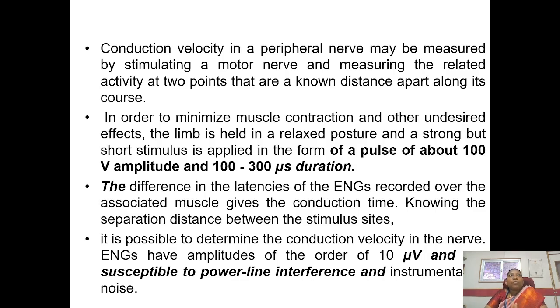In the case of a few patients, like stroke patients or paralysis patients, definitely the nerves will not conduct properly. So for those kinds of patients, how do we check whether the nerve conduction velocity is proper or not? In a biomedical instrumentation lab, if you're biomedical students, you might have done an experiment. You will have a set of ring electrodes placed over the finger, and another surface electrode placed above the elbow or the wrist.